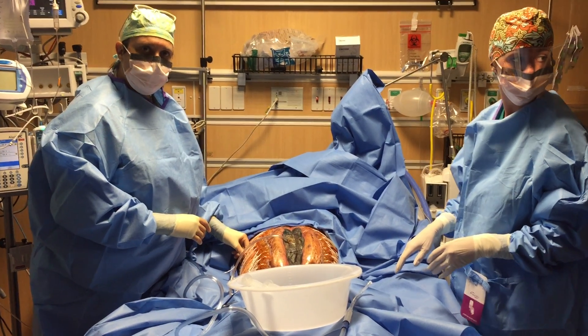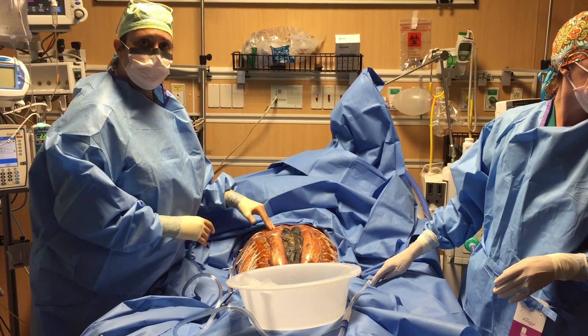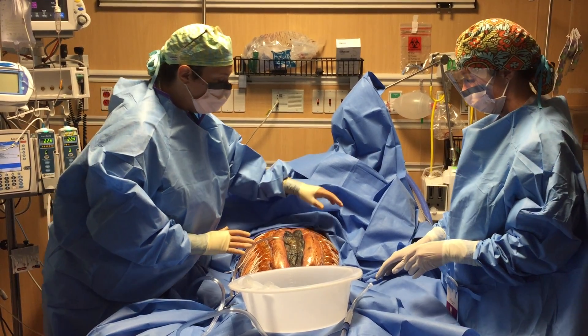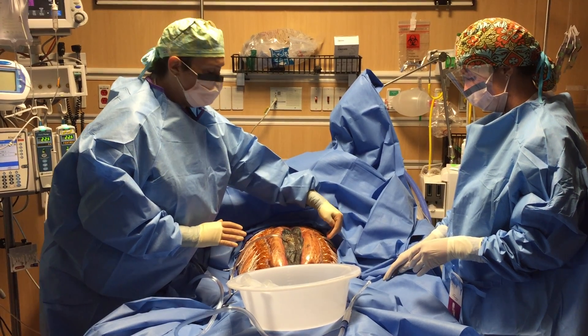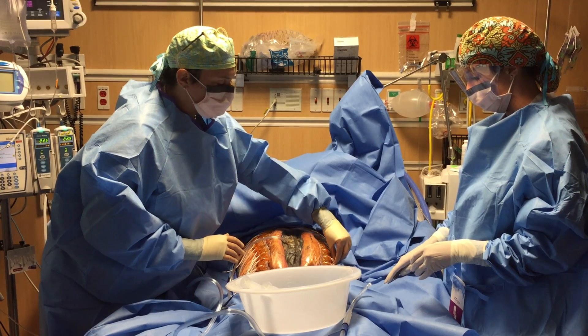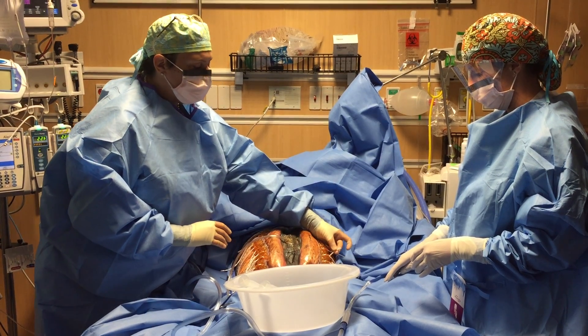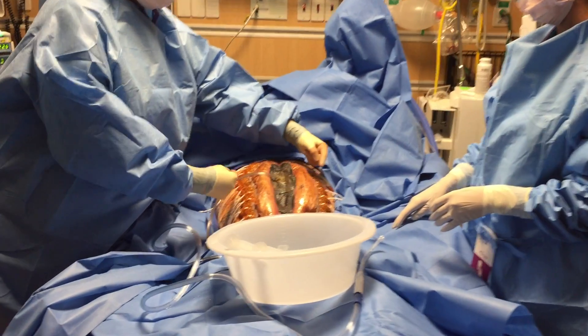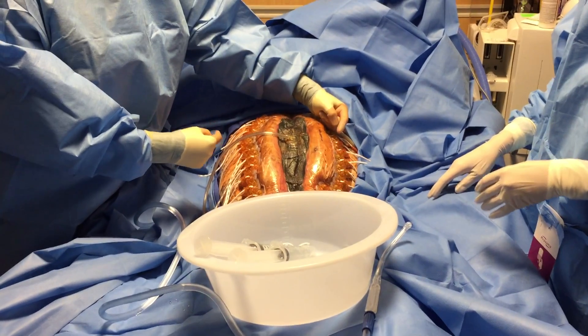This patient has had this on for two and a half weeks. We have zero breakdown at the button surfaces, which is fantastic. Over here we've got a G-tube and a J-tube. If you'll notice, the elastomers are kind of short over here — this is the original length we put in at the time of surgery when the fascial distance was 26 centimeters.